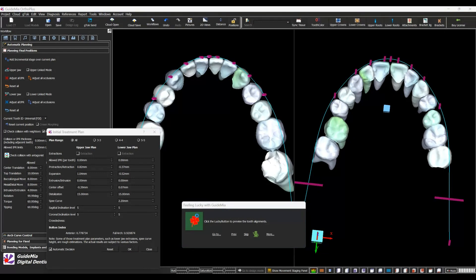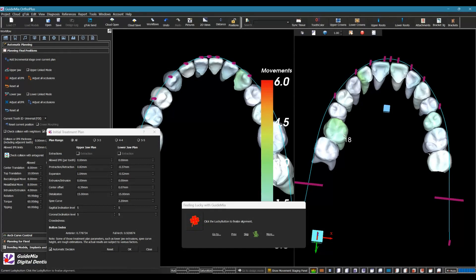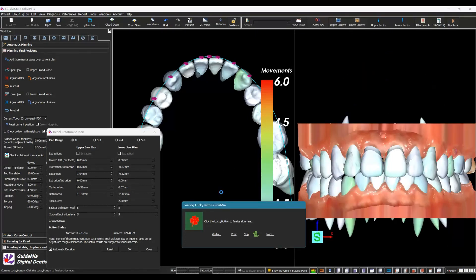We are doing initial alignment — it's going to align the teeth against the arch curves. Sometimes, if you look at a given tooth, the movements can be substantial. We have controls so that we don't move it too much; there are settings under the tools menu where we can control whether to allow substantial movements or not. Click the Lucky Button to finalize alignment.